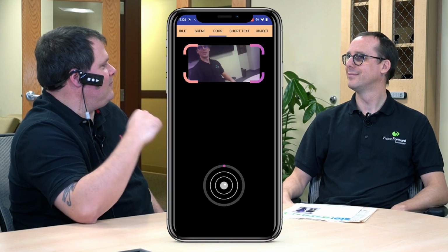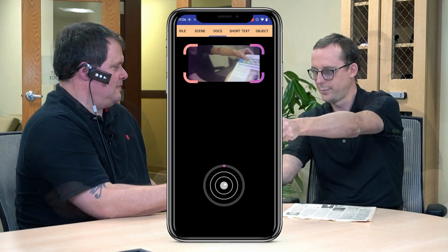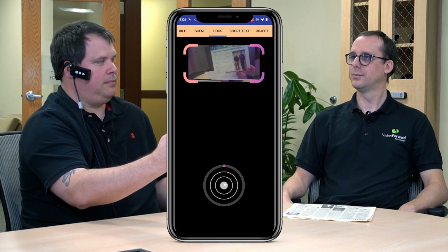All right, this time I'm going to use speech commands. I'm going to hold down the round button that's in the middle. Document. Document scan. Okay, nicely done. Now here is your document. Move left. Document aligned. Hold steady. Ooh, I love the sound effect. Me too.